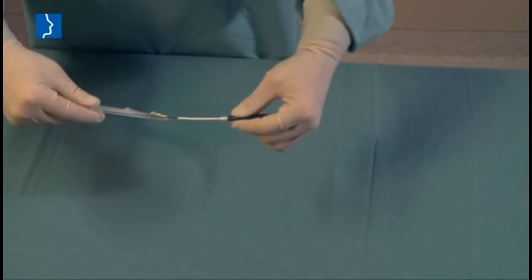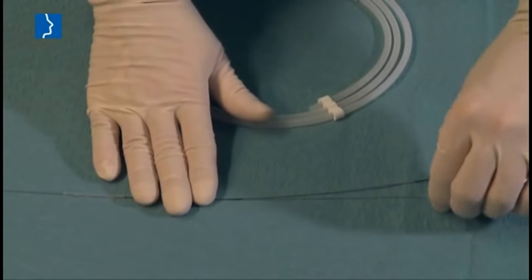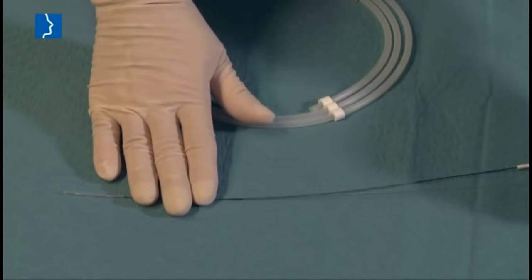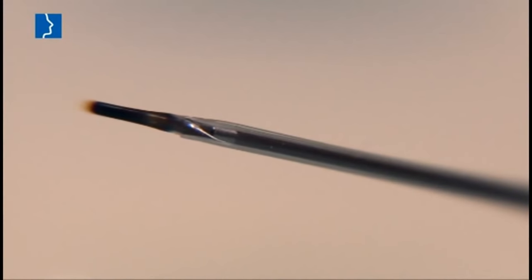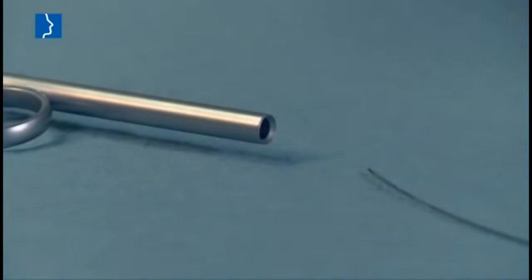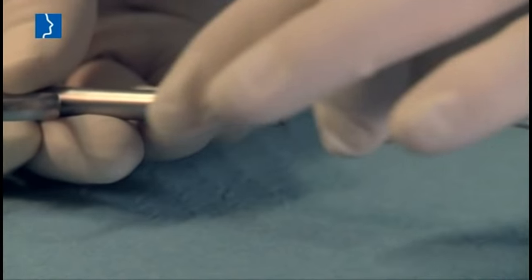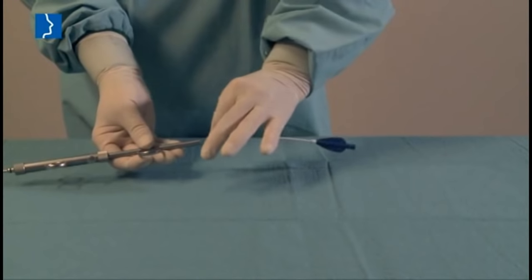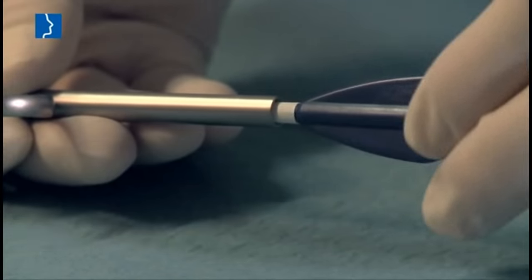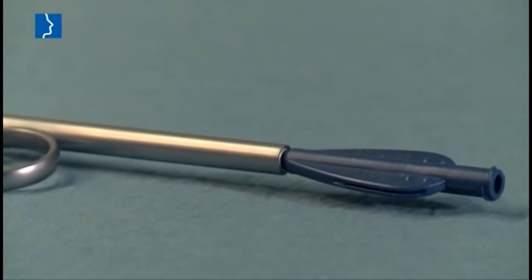Carefully remove the balloon catheter from its protective tube. Remove the stabilizing wire and the protective cap from the distal catheter part. Then insert the catheter into the insertion instrument, making sure that the white shrink tube has been inserted completely. This guarantees that the balloon is inserted into the eustachian tube in the defined length only and does not damage the mucus membrane, since it is completely contained in the instrument.